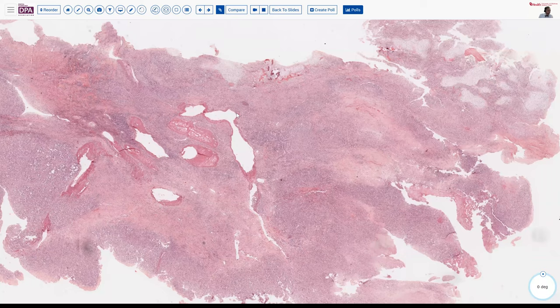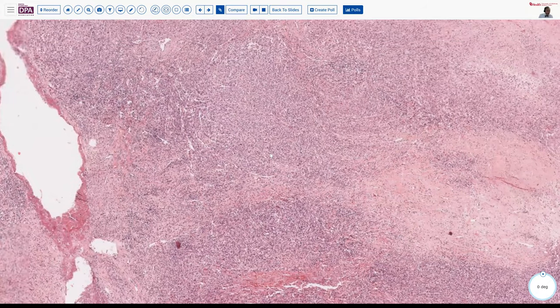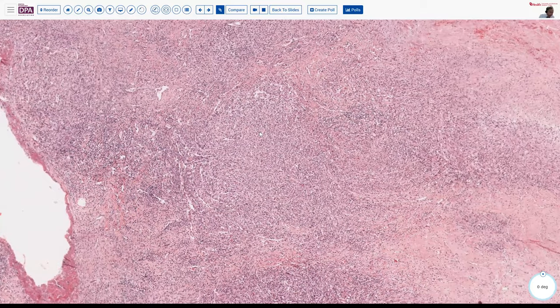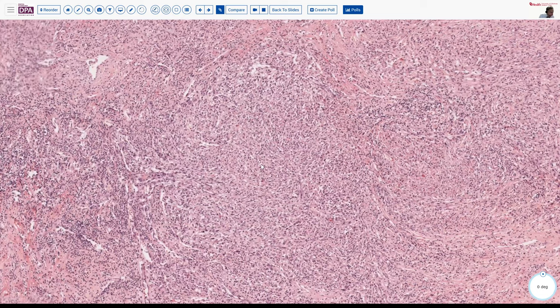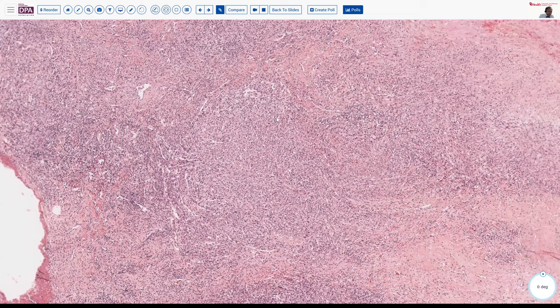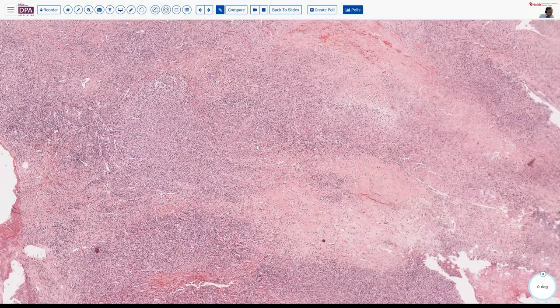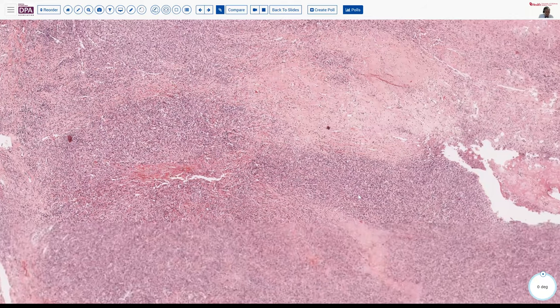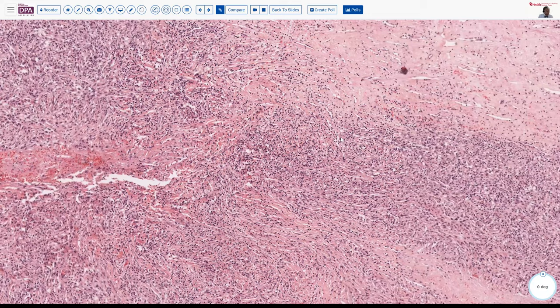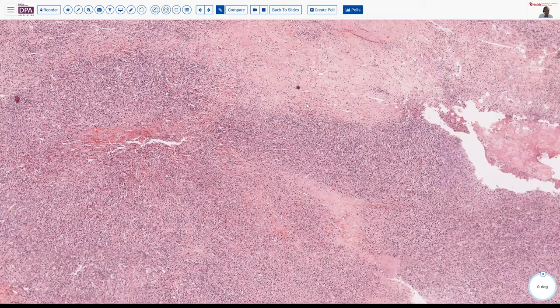But we have areas of fibrin, we have a little bit of vascularity, and then we have this spindle-shaped proliferation here with fairly cellular and atypical cells, not high-grade malignancy per se, or not anaplastic, but quite cellular in these areas. So a spindle cell proliferation that looks like it's probably malignant, with a degree of fibrosis and a degree of change here. I'll admit that some of my residents thought this might be an intraatrial myxoma. It does not at all resemble an intraatrial myxoma. It has a higher grade appearance than that would, much more cellular.